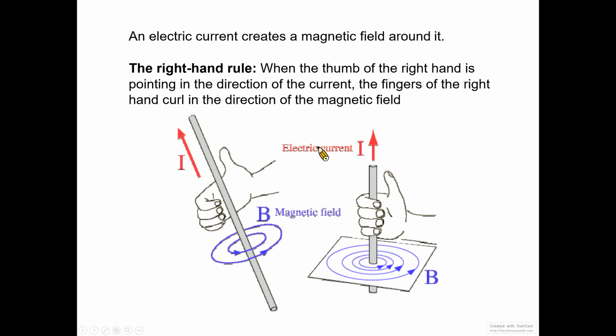First, we can measure them directly. But there is also the right-hand rule, the combination of the electric and the magnetic fields, so we can use magnetic detectors to detect the electrical flow in the brain.